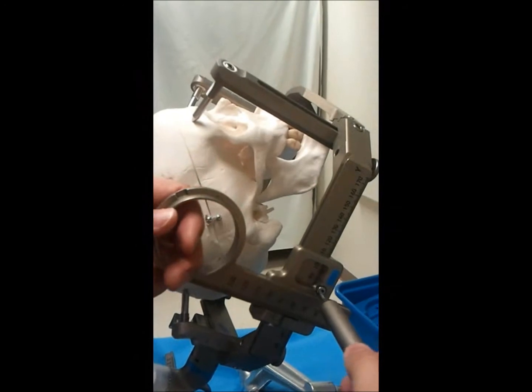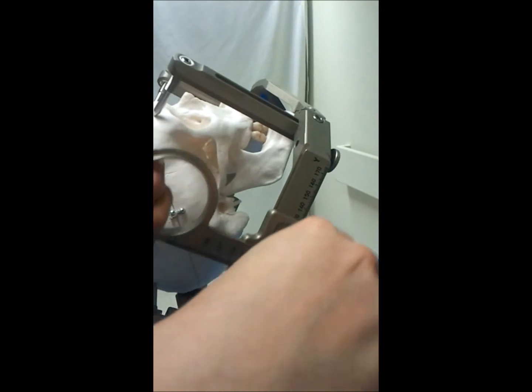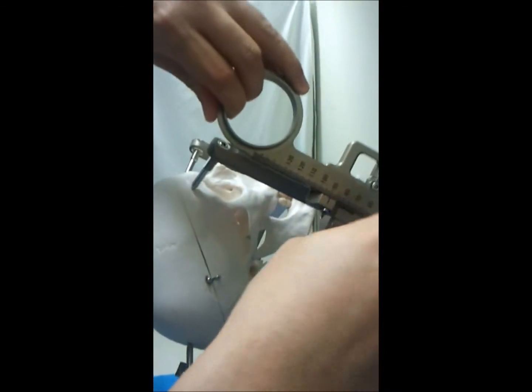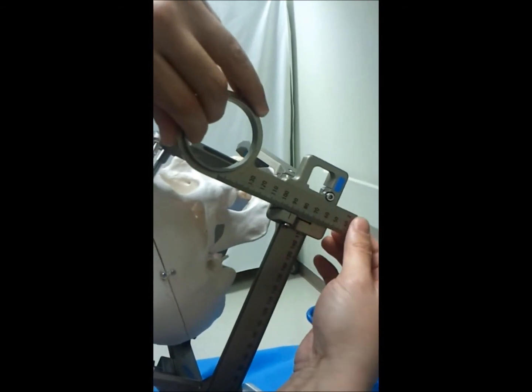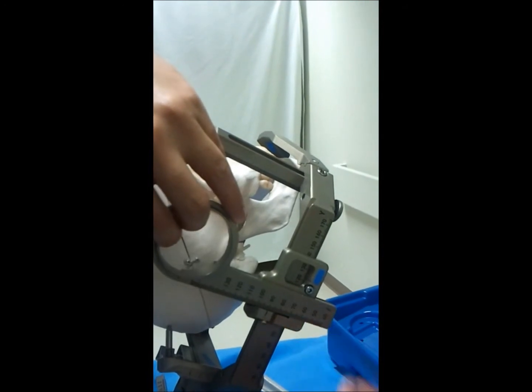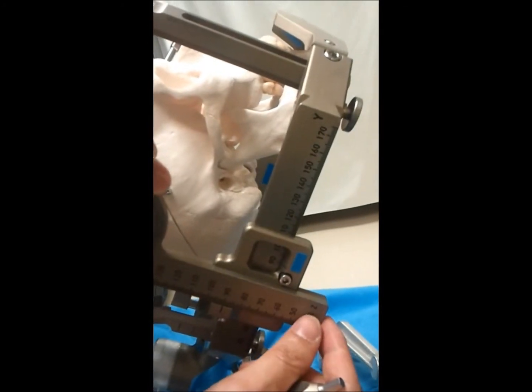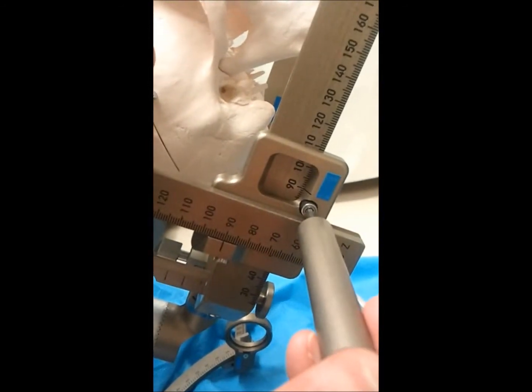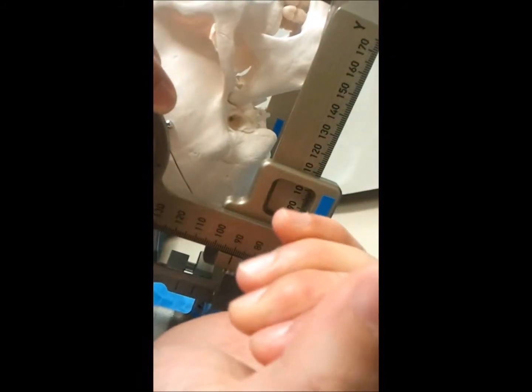When placing each side on, again, it's good to have two individuals involved, one to be sterile, holding a sterile screwdriver, and to help slide it onto the rail, and then another individual who doesn't have a sterile screwdriver holding it, and that helps slide this on correctly if it's not wiggling correctly, just to help it wiggle and to get it down. And then both individuals can check each other, and then being very careful and very detail oriented about getting the measurement to the level, to the appropriate AP diameter, and that's our AP coordinate.